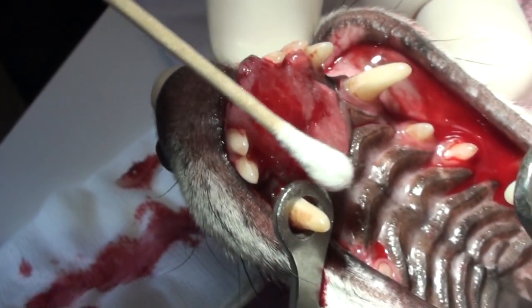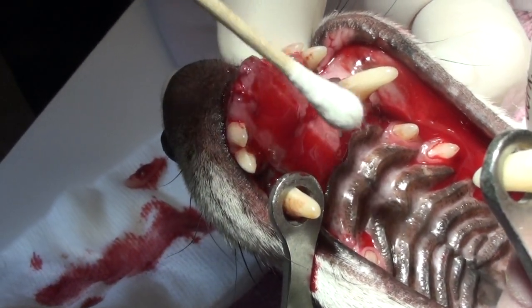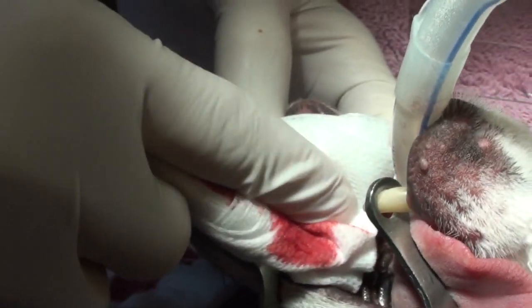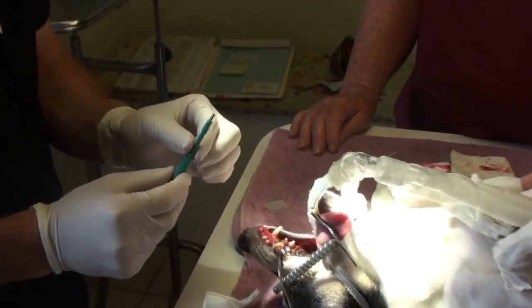This tumor is over on the hard palate, or the roof of the mouth. It's involved that tooth, and it fell out easily. So we have to take a punch biopsy to see if the tumor will spread dangerously, or if we burn it off, whether we can get rid of it. So we're going to take a punch biopsy of the lesion.